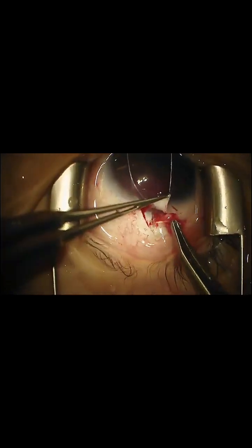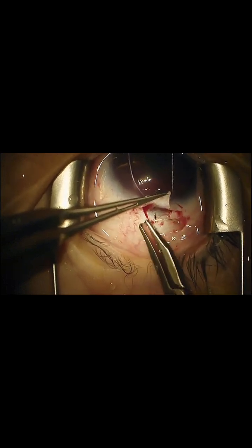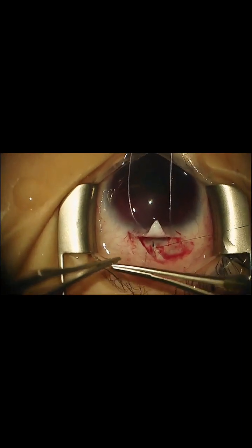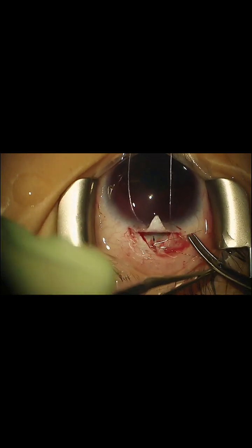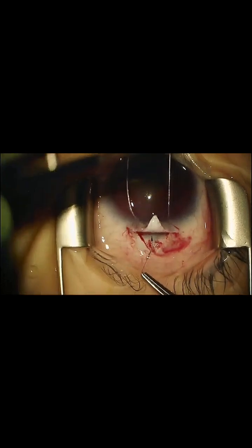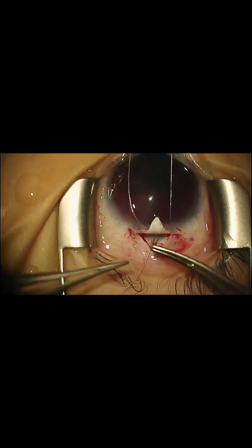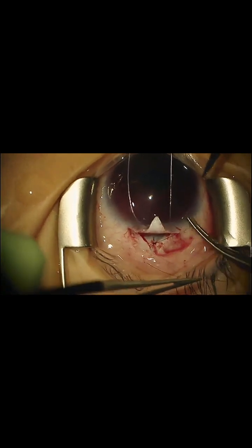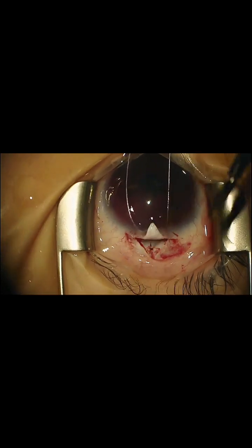These might filter for a while, but with no anti-metabolite, it's just going to seal off. The reason I don't like trabeculectomy so much is that you have to put so much mitomycin on them that the blebs end up very thin and cystic. In order to get the bleb to work, it becomes so thin and cystic that there's a significant lifetime risk of endophthalmitis. So this little bit of blood that's in the anterior chamber, I usually don't bother to irrigate out. It'll be there for a day or two and then be gone. You see the same thing with goniotomy.